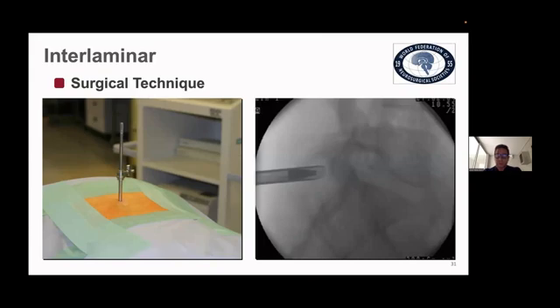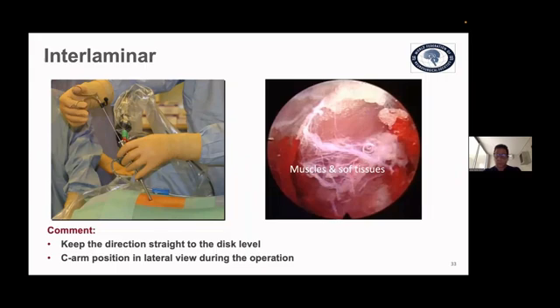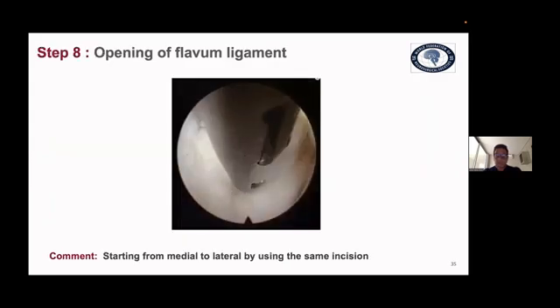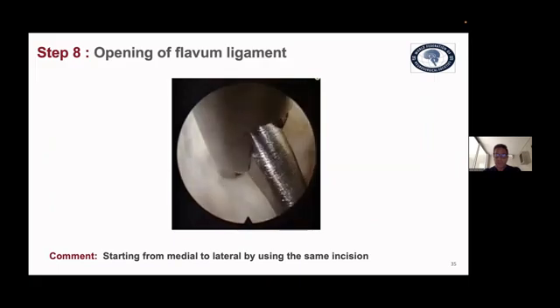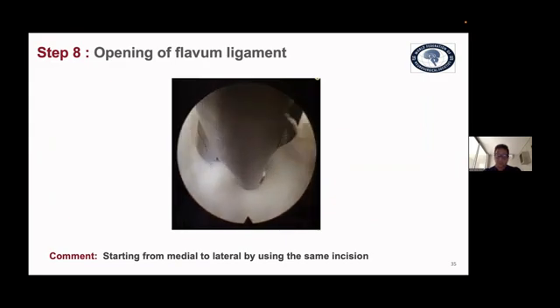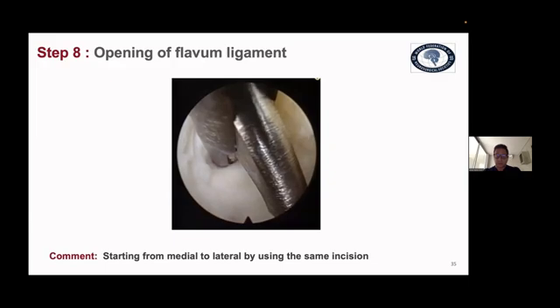We insert the dilator until we feel the flavum ligament, and we switch the X-ray to the lateral view, and we insert the cannula of the endoscope. We insert the endoscope, and we start to remove the muscles and soft tissues. We identify the flavum ligament and prepare the soft tissue using the radio frequency probe, and we open the flavum ligament from the medial to the lateral aspect until we reach the medial border of the facet joint. And we have to push all the time and perform lateral stretching of the ligament in order to see when we cut the ligament and avoid any injury of the neural structures.